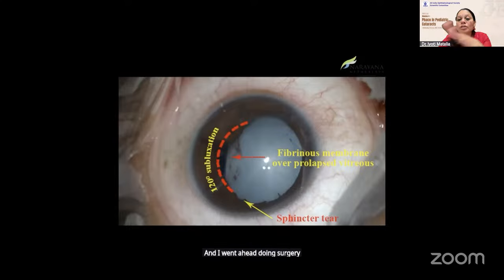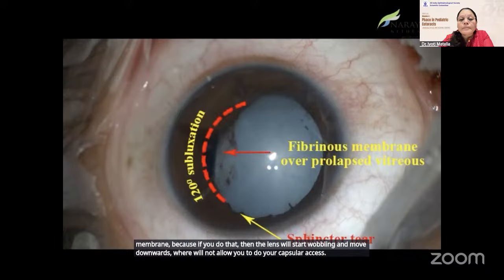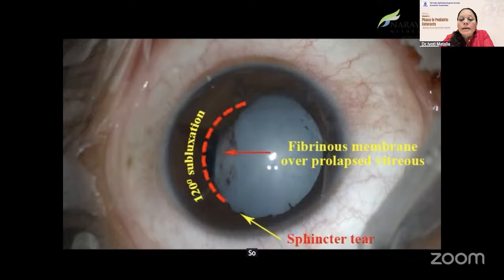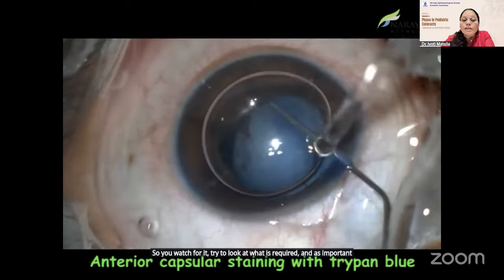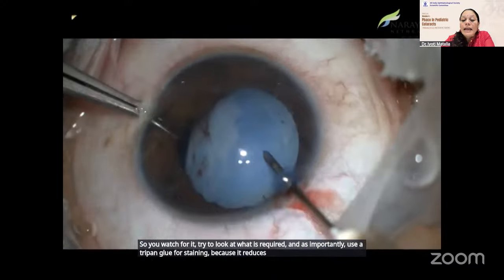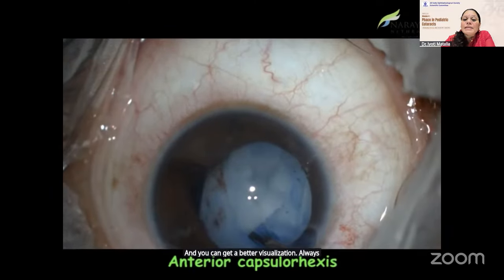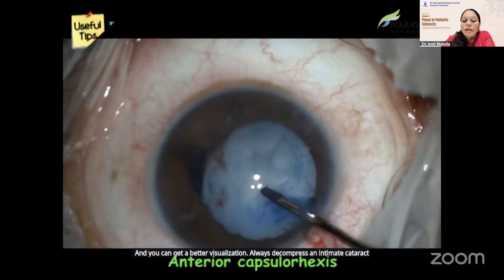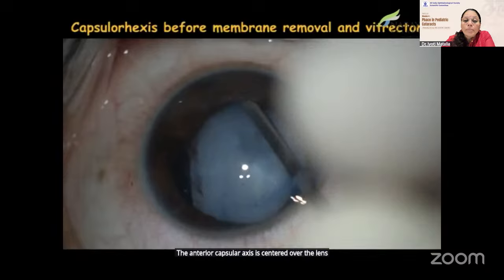Remember, we do not try to release this membrane, because if you do that, then the lens will start wobbling and move downwards, where it will not allow you to do your capsular rhexis. So you watch for it. Try to look at what is required, and as importantly, use trypan blue for staining because it reduces the elasticity as well, and you can get a better visualization. Always decompress an intumescent cataract. You don't want it to run away. The anterior capsular rhexis is centered over the lens, not over the pupil.